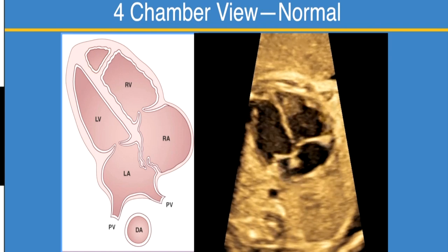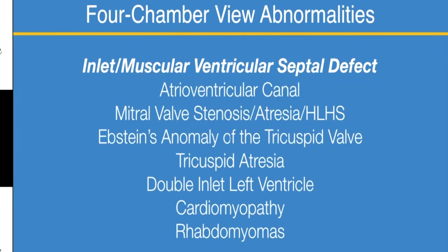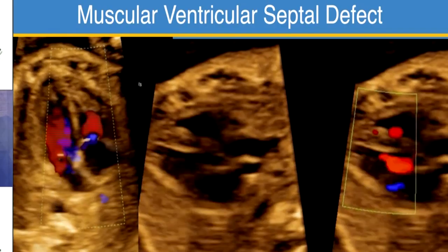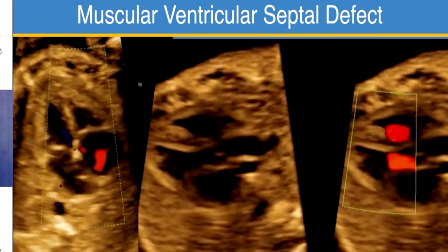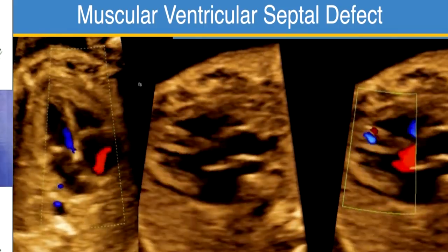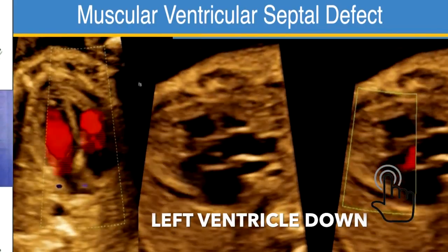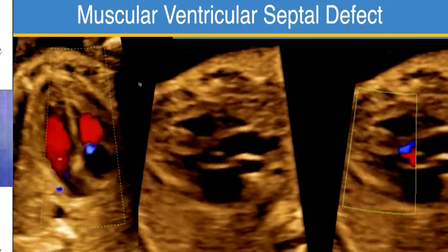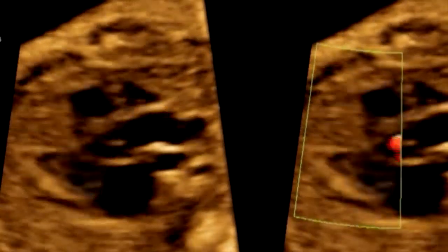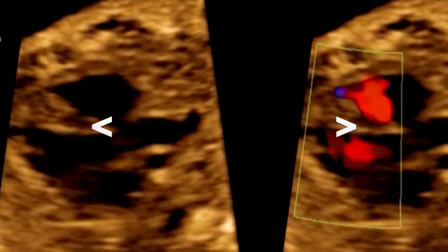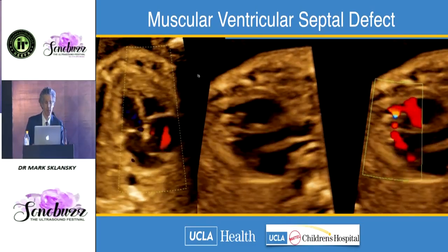The most common four-chamber view abnormality, besides an echogenic focus, is an inlet or muscular ventricular septal defect. The concept of being perpendicular rather than parallel applies both for 2D imaging and for color Doppler. You want to be perpendicular to the septum — this is my favorite view with the LV on the bottom — and color also needs to be perpendicular to avoid missing the defect.